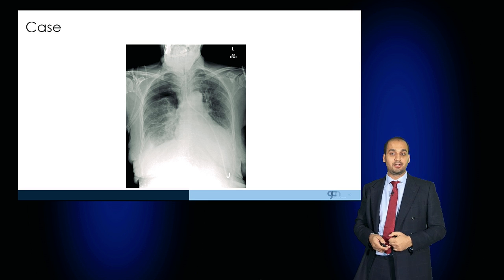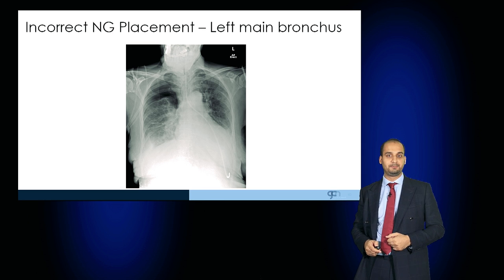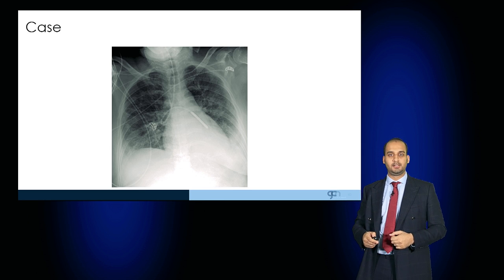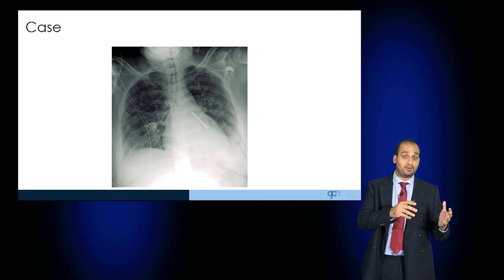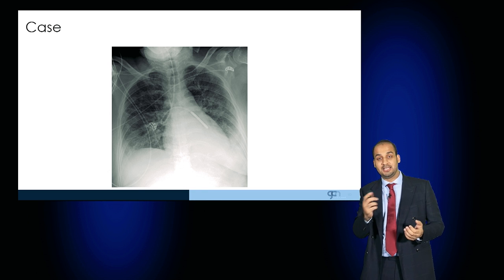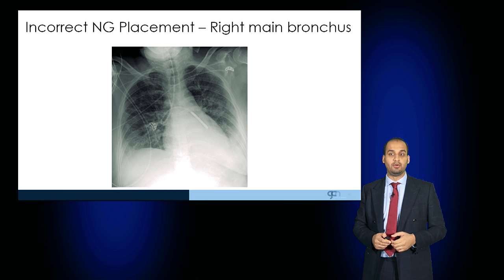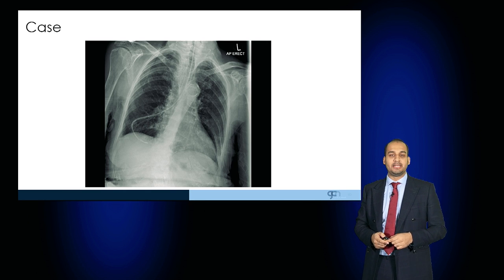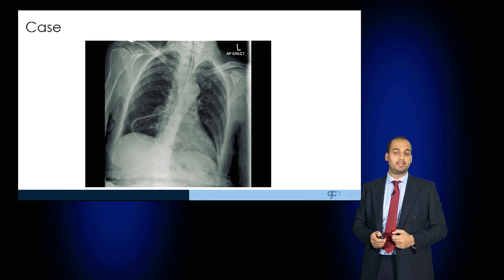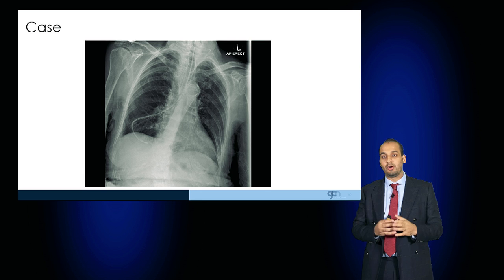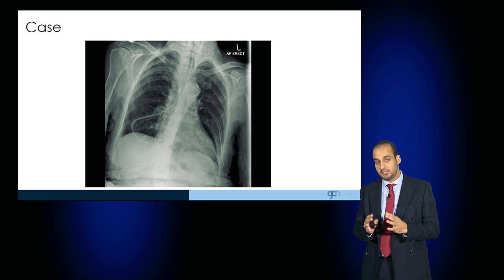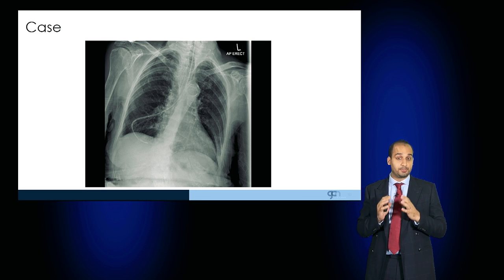This is another case of an incorrectly sited NG tube — this one has gone into the left main bronchus. Here is an NG tube that unfortunately passed into the right bronchus, curved there, and then passed into the left bronchus — again very unsafe and needs to be removed. And here is another one. There are a lot of these to demonstrate how easy it is for the NG tube to be sited in the wrong place, and how important it is to have a senior review prior to feeding.